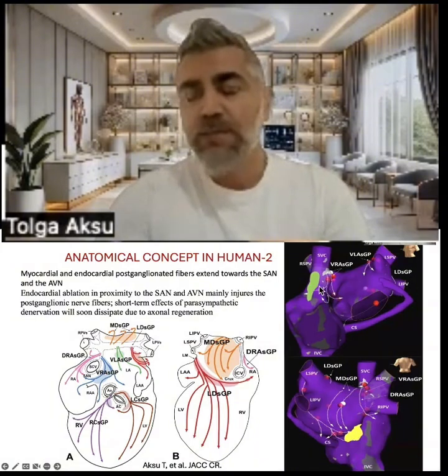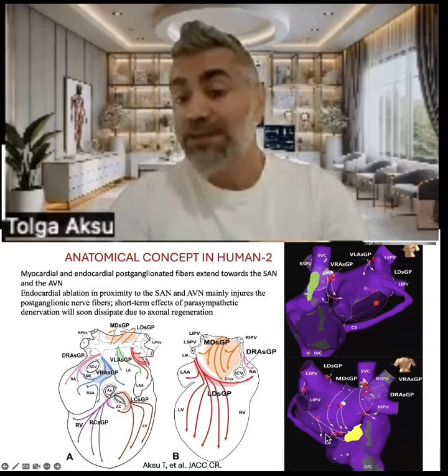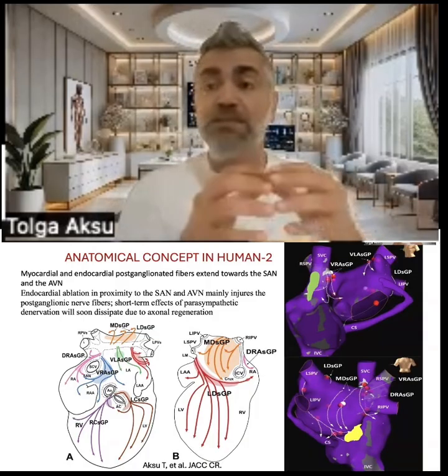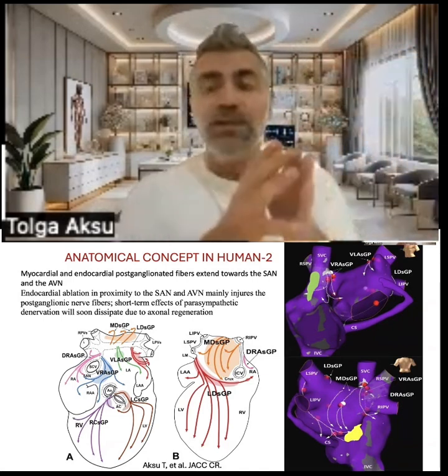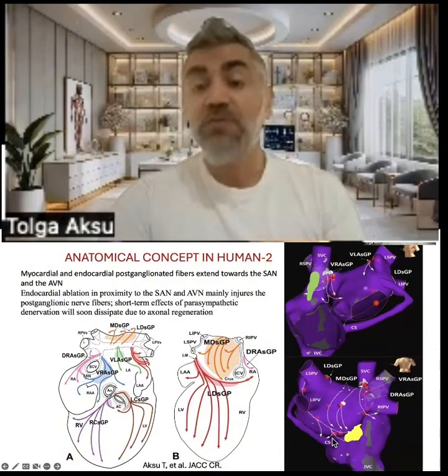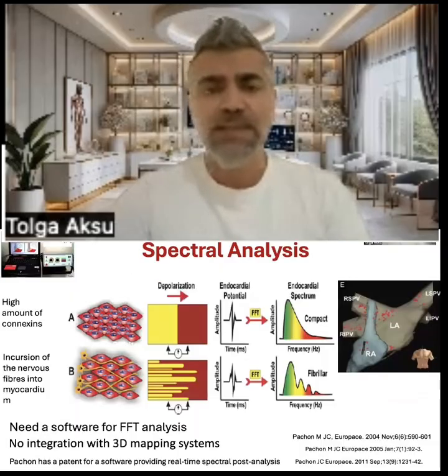So during ablation around the sinoatrial node or AV node area, you can first eliminate these postganglionic neuronal fibers from the autonomic ganglia to the target organ, and although you see a similar acute success, like an increase in sinus rate or resolution of AV block at the beginning of the ablation, for permanent damage we should target the real autonomic ganglia sites. Different groups use different techniques.